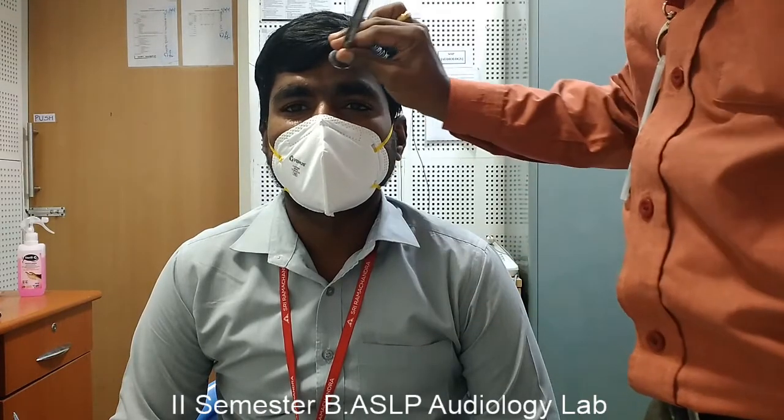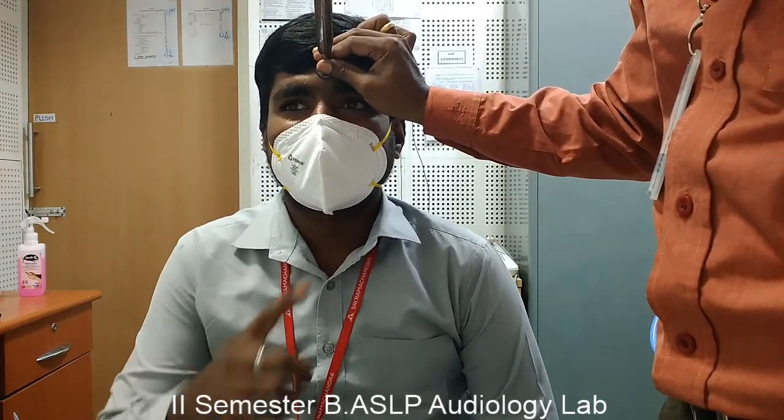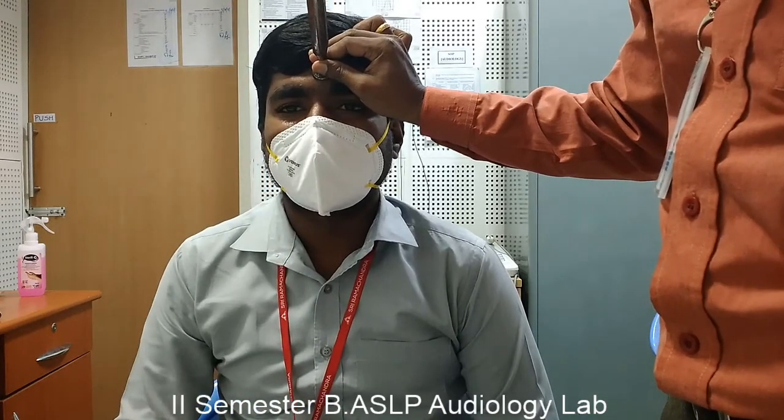The tuning fork has to be struck, and the vibrating tuning fork base will be held at the midline of the skull. The subject will be asked to indicate where he or she hears the tone louder — whether it is perceived at the center, equally loud in both ears, or louder in either ear.